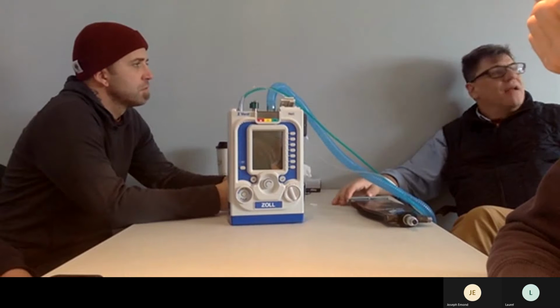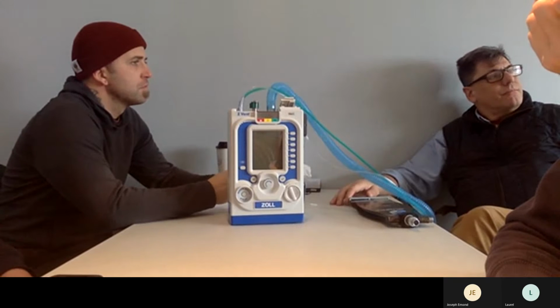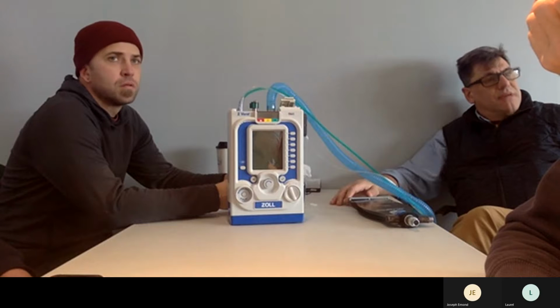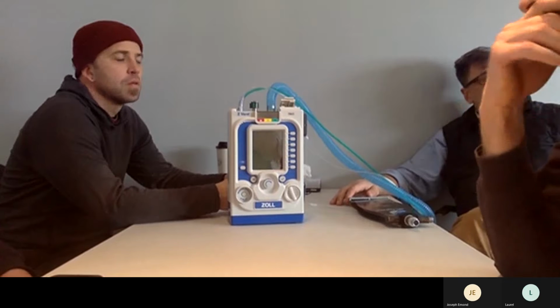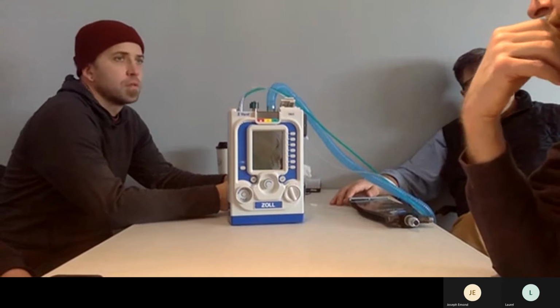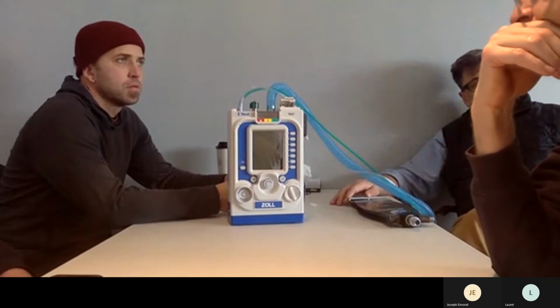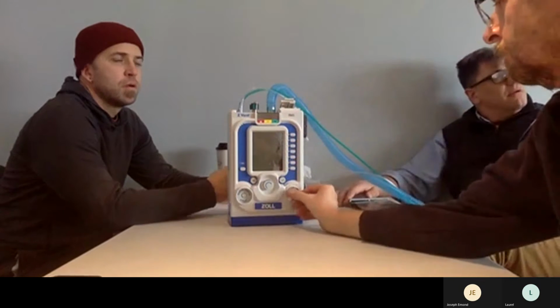So at 5/10, my peak inspiratory pressure on my IPAP will be 10. And 10/5 is 10, on bi-level mode. So bi-level is not additive. It's targeted. A is A, B is B. Versus CPAP plus pressure support, 5/5 would be the same thing.